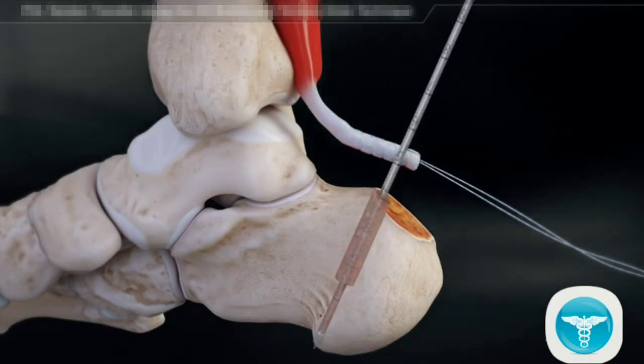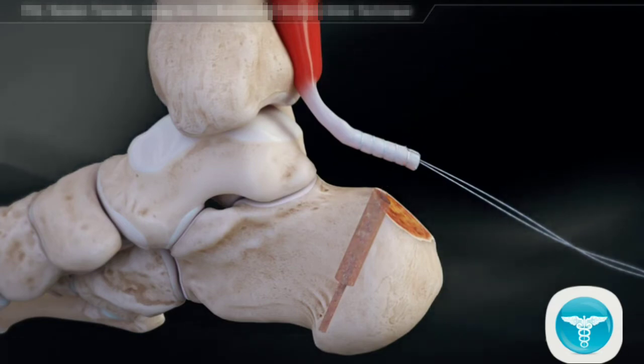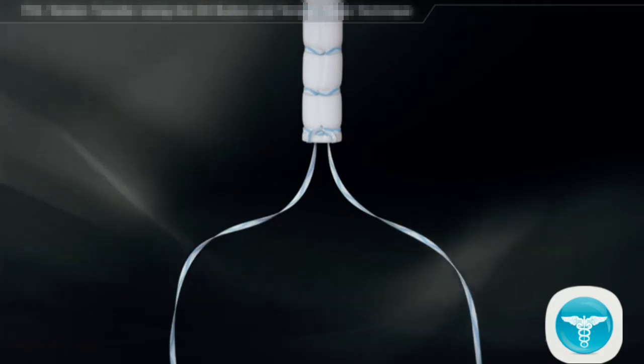Note, when reaming over the 3.2 mm spade tip pin, make sure the pin does not push through the plantar fascia and skin. Remove the spade tip drill pin. Irrigate to remove bone debris. Remove the traction stitch and any tendon past the second mark.